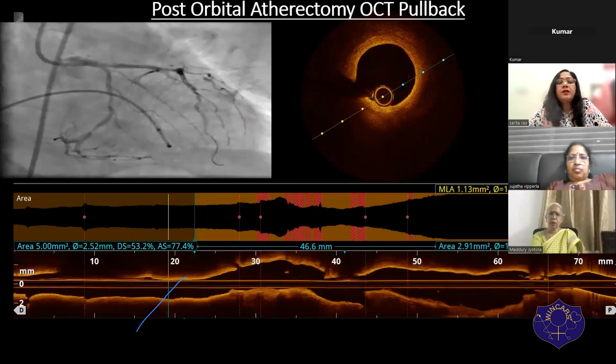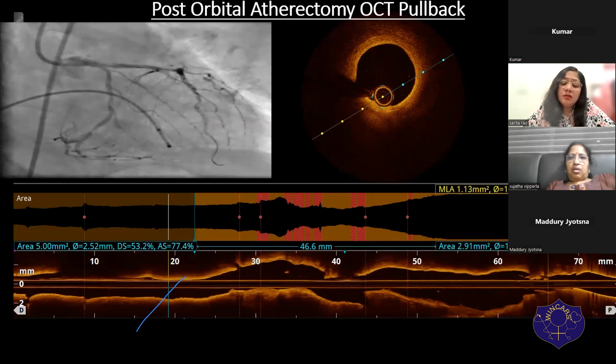I'm still not satisfied. Do you not require first testing with the balloon, whether waist is there, and then increase the speed? Or otherwise, do imaging and then see whether you have to go for the higher speed. Okay. So yes, we could have done that, but we decided that let me test with the balloon and see what the situation is.